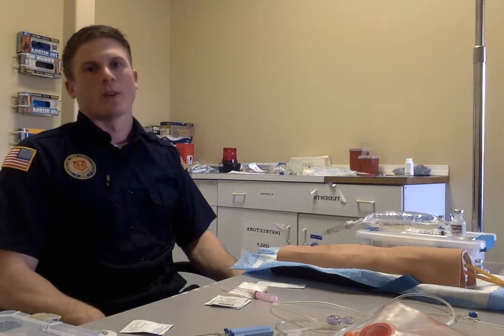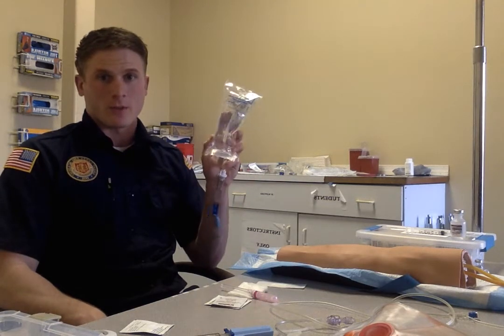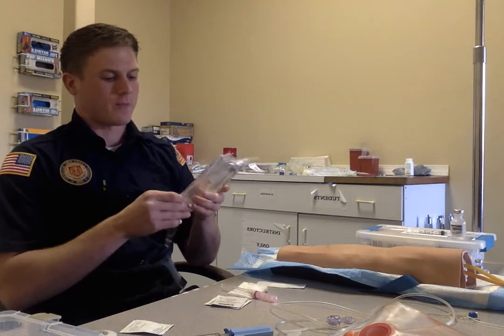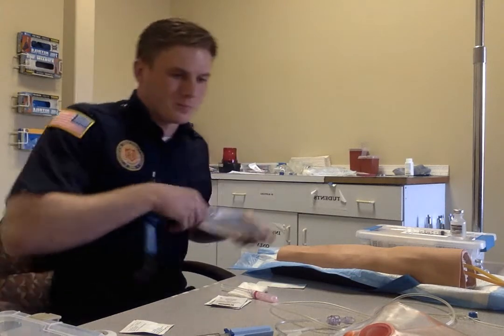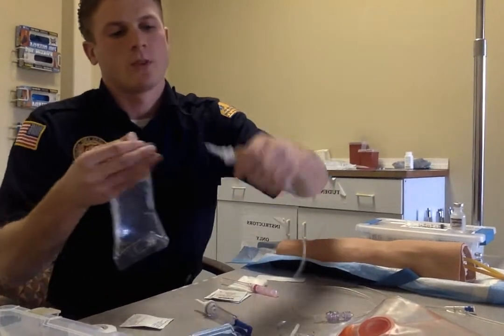Today we're going to be showing you how to set up an amiodarone drip. First off we're going to start with our 250 bag of normal saline. We're going to check our expiration date, which is 9 of 18, so we're all set there. Make sure that the fluid is clear and nothing's in it. Then we're going to hook up our tubing to it.